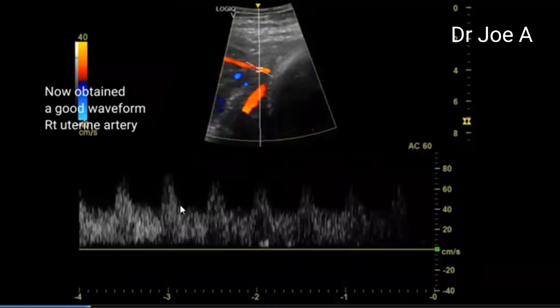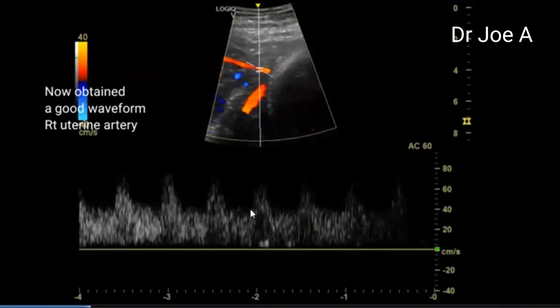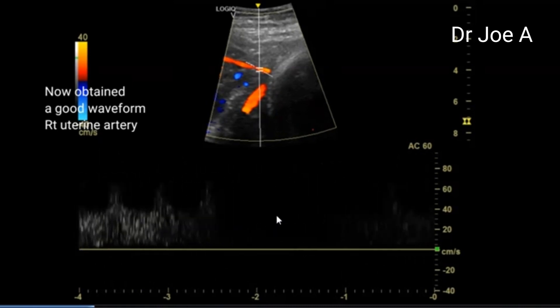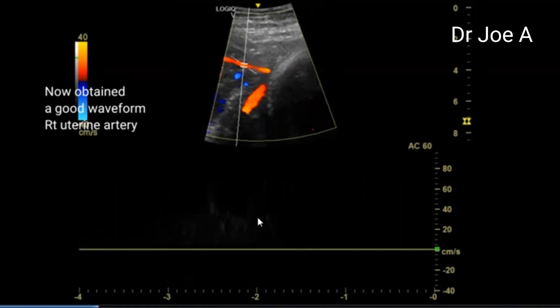You can see the systolic wave and the diastolic part of the waveform — systolic, then the diastolic part. This baby is slightly smaller for dates by about two to three weeks, and the gynecologist wanted to know if this baby had an abnormal Doppler. The waveform obtained is reasonably good — a normal uterine artery waveform.